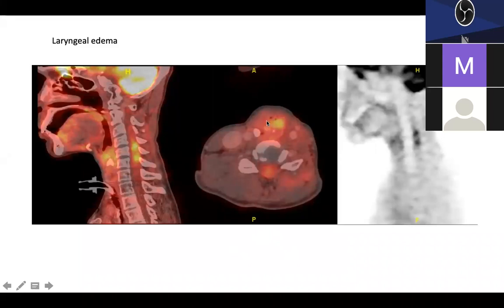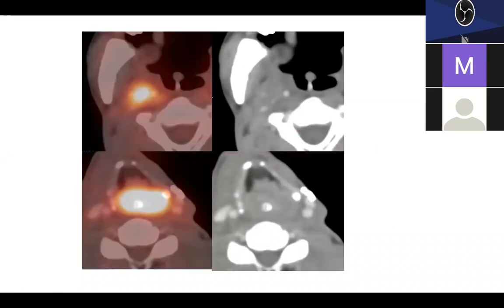So now see this image and now see this other image. This patient also was a buccal mucosa patient treated initially, then presented with stridor. They did a tracheostomy for the stridor, and we did a scan. Here we can find soft tissue occluding the larynx with intense FDG uptake. So here, is it recurrence or is it laryngeal edema?